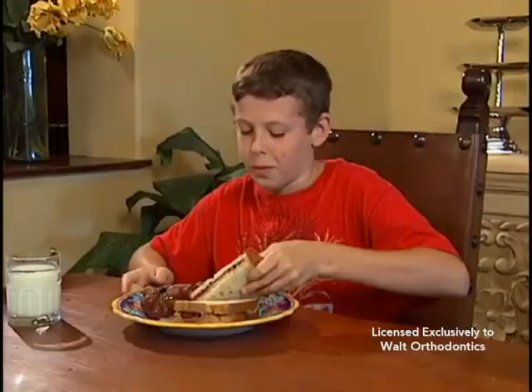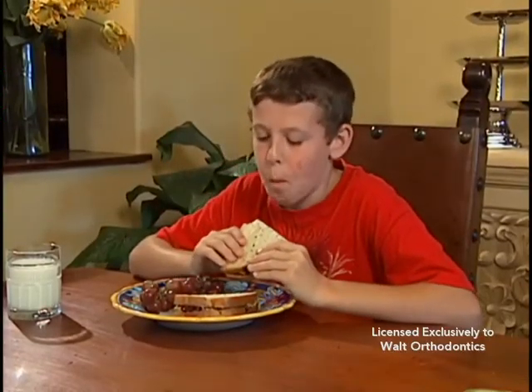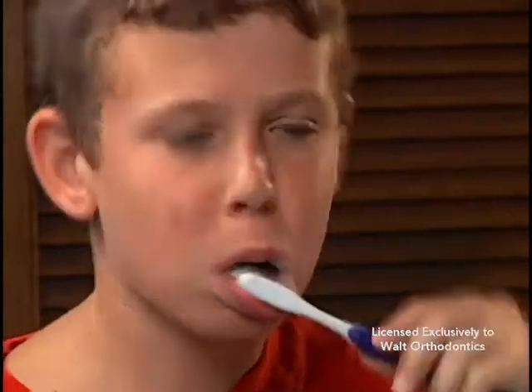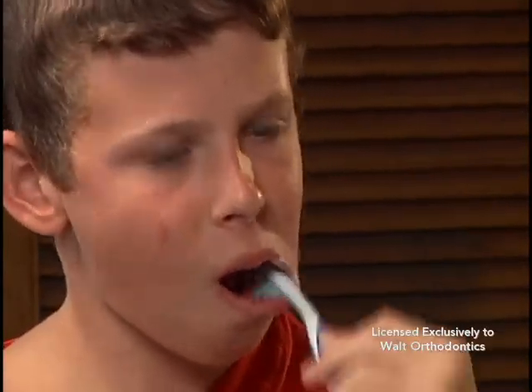You may remove the elastics only when eating your meals or brushing your teeth. Leave them in during snacking, and be sure to replace the elastics with new ones immediately following mealtime and brushing. Part-time wear will not move teeth, but it does cause them to be constantly sore.